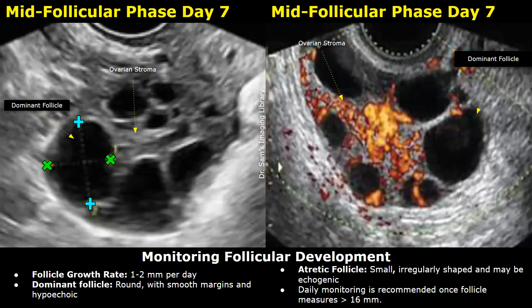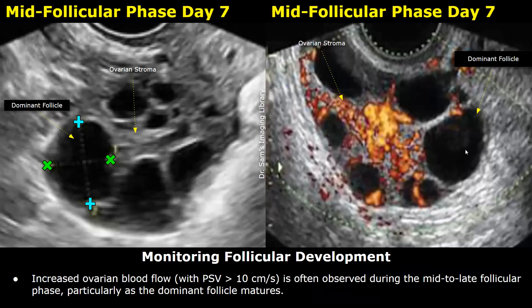The dominant follicle is round with smooth margins and is hypoechoic. An atretic follicle is a regressing follicle — it is small, irregularly shaped, and may be echogenic. Once a follicle reaches 16 millimeters in diameter, daily ultrasound monitoring is recommended. Increased ovarian blood flow with a peak systolic velocity of 10 centimeters per second or greater seen on Doppler is a good indicator of impending ovulation, often observed during the mid to late follicular phase from day six onwards.